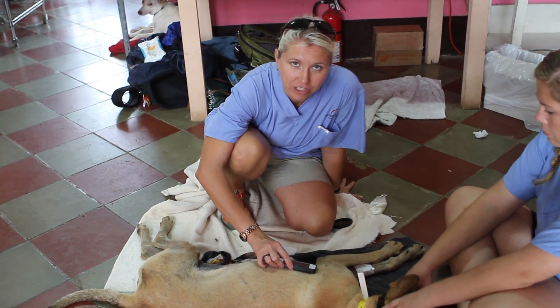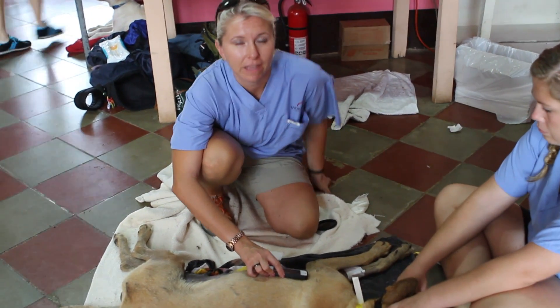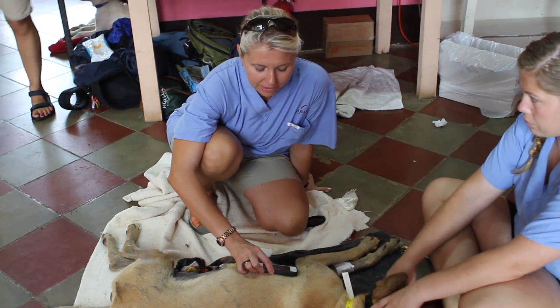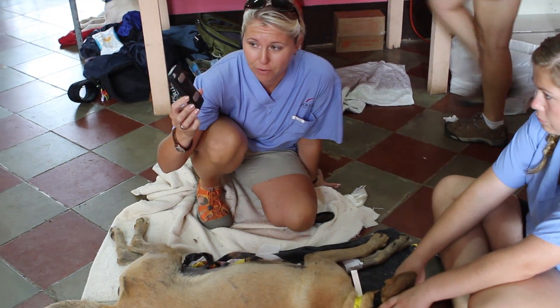This is the Alive ECG iPhone case and app, made by Alive Corvette. We're using it down here at the World's Best Program in Nicaragua. It's a really easy case that snaps onto an iPhone.